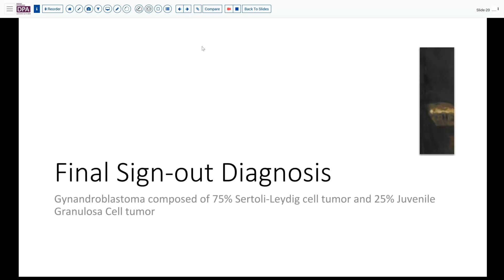Thank you for wading through that case. There are a few more digital slides on the presentation with links provided. We estimated here that there was 75% Sertoli-Leydig tumor and no more than 25% juvenile granulosa cell tumor or sex cord stromal tumor, NOS, in this particular case. In general, you should report the percentages of each component that you identify, although that can be quite subjective and subject to variability between observers.